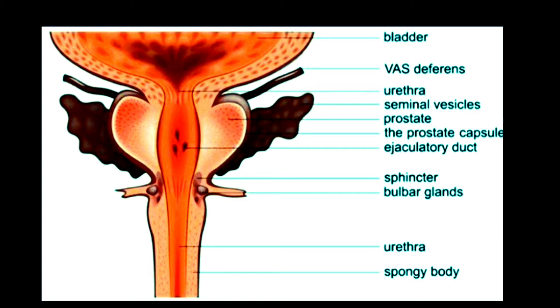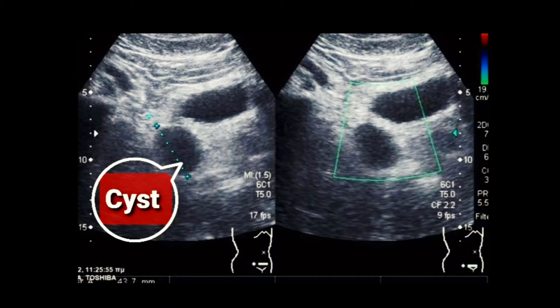The cyst of the seminal vesicle is not very common — it is a rare condition. This live case shows you the seminal vesicle cyst. This is the ultrasound picture of the seminal vesicle that is below the bladder. To locate this cyst, you have to place the probe of the ultrasound onto the suprapubic region. You have to press deep to see the prostate, cyst, and the bladder.